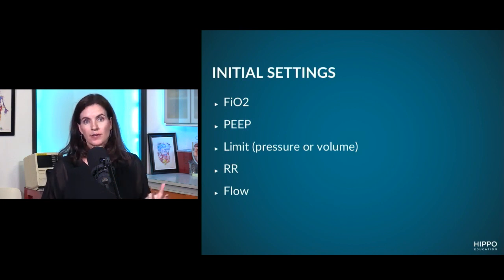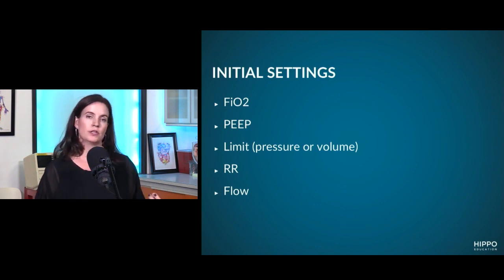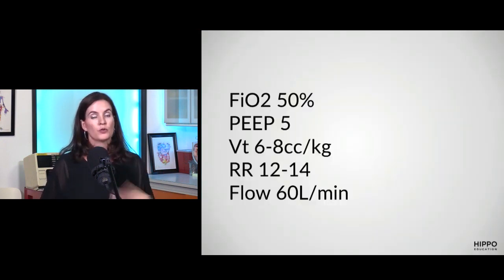And the thing that made this concept click for me is when I understood that this is like a procedural sedation. If you're going to do a procedural sedation on somebody, you pick the drugs you want to use and you start somewhere at some safe dose, and then you titrate based on how that individual patient is responding to where you've started. A ventilator is the same way. You memorize an initial safe starting point and then you adjust. And so for me, these are the initial settings that I use.